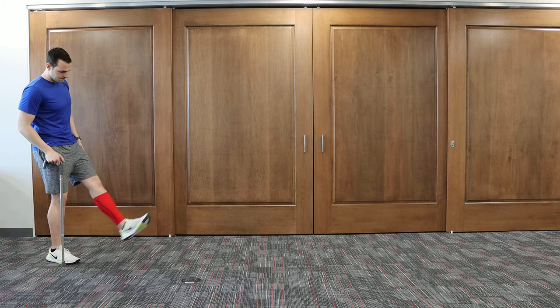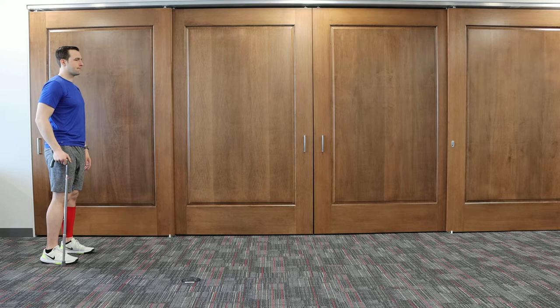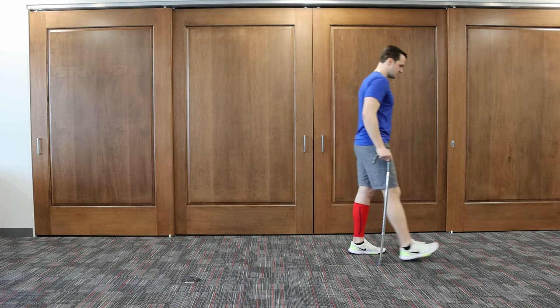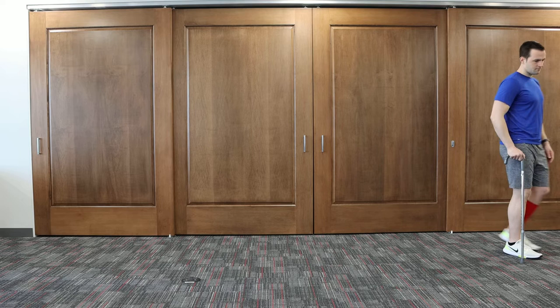For a straight cane, the most commonly used gait pattern is a two-point step-through gait pattern, where Matt will lead with the assistive device and the affected side landing at the same time. The unaffected limb will step through those two points of contact as he makes his way through the path.